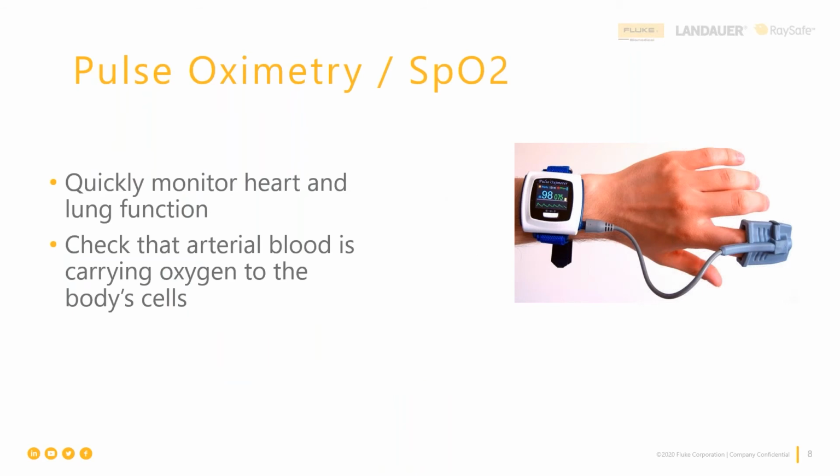So here's the first dive into the technology, because we know that arteries carry oxygenated blood throughout the entire body. We know that arterial blood comes from the lungs, where it's picked up that oxygen and it gets pumped through the left heart chambers to the aorta and then to the arteries. And that arterial blood moves in pulses as the heart beats.